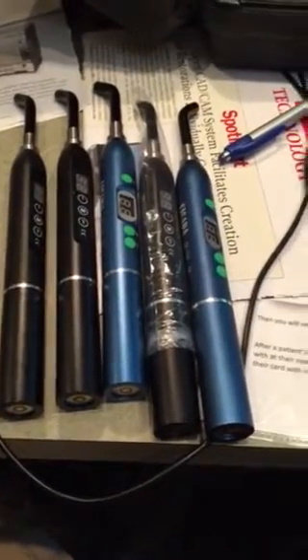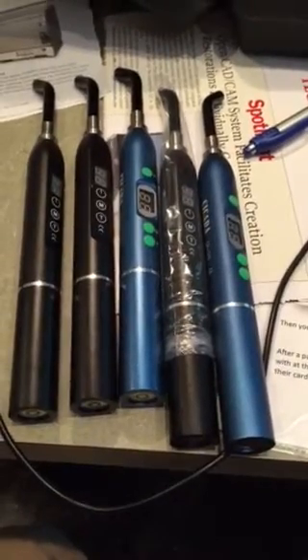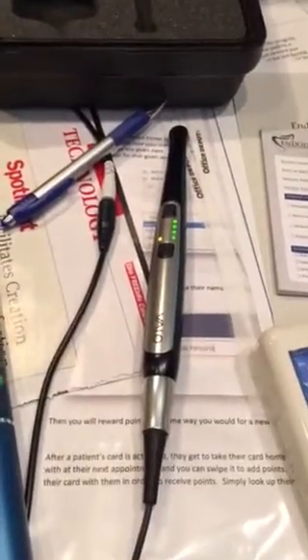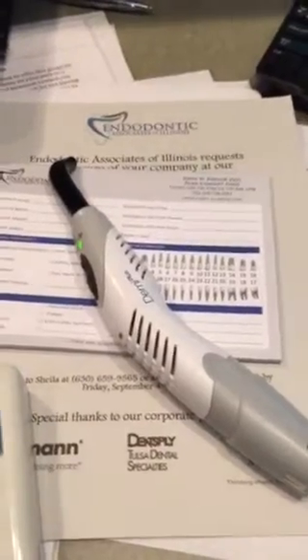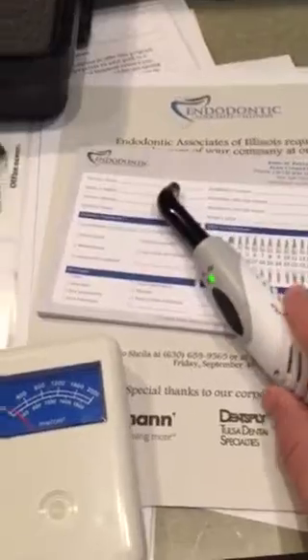I'm going to test some of my curing lights. I've got five of the cheap Chinese ones — I had two more but they fell and broke. I have a Velo that has literally never been used in the mouth, and a Demi Plus that has been used occasionally — I keep it for veneers, for the turbo tip. So we've got our little sensor here.